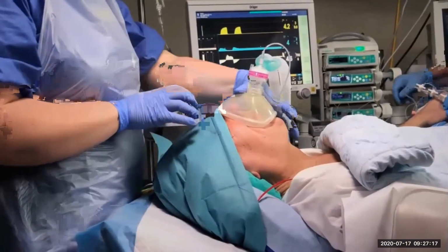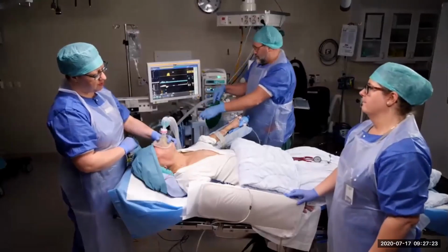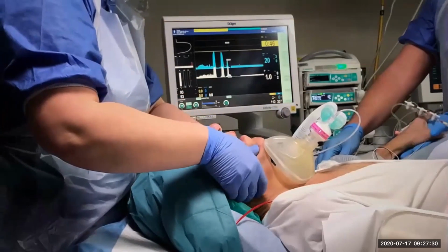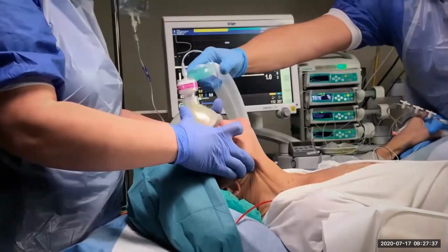Open the airways. A 2-finger chin lift may be all it takes. If this isn't enough to be able to ventilate the patient, the next step is a jaw thrust. Open the patient's mouth with your thumbs on the patient's chin and place your fingers firmly behind the angle of the mandible and lift straight up in a decisive manner.